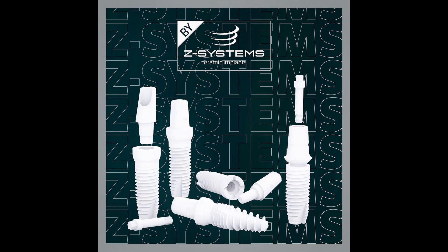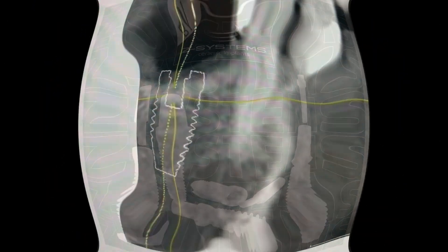In this case I'm using metal-free zirconia implants by Z Systems. These come in many variants including one-piece, two-piece immediate, and bone level. For this lady I use only the two-piece gum level implants.